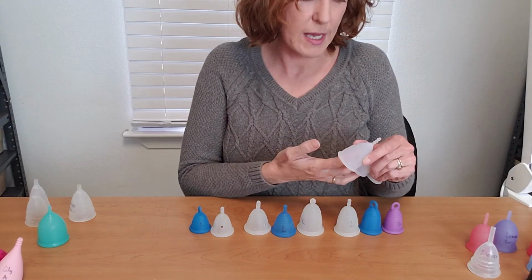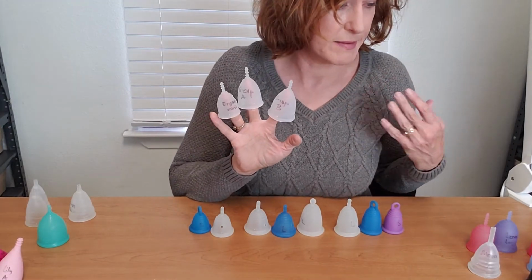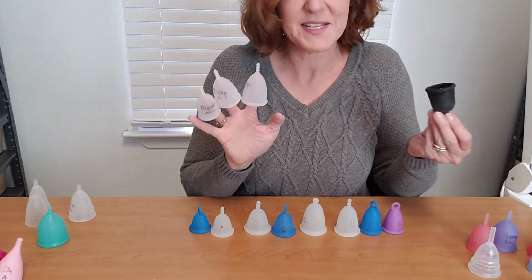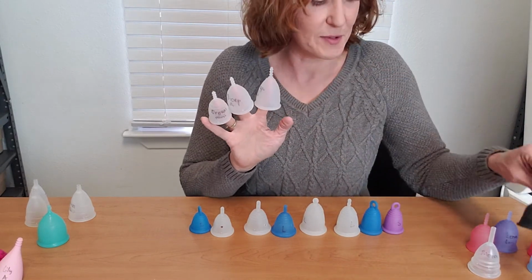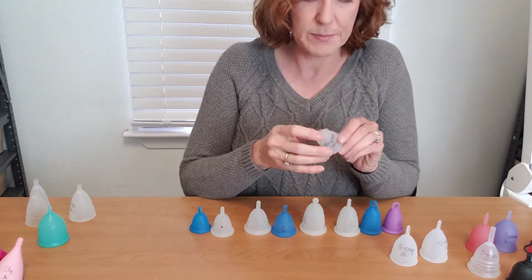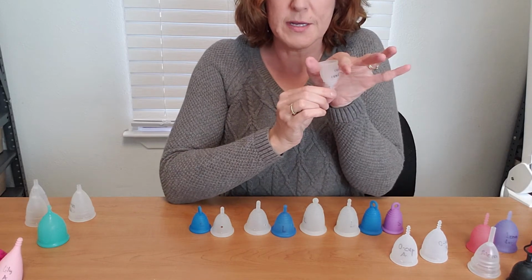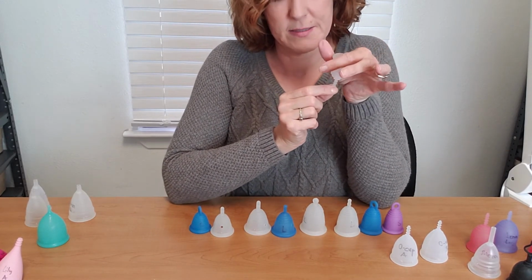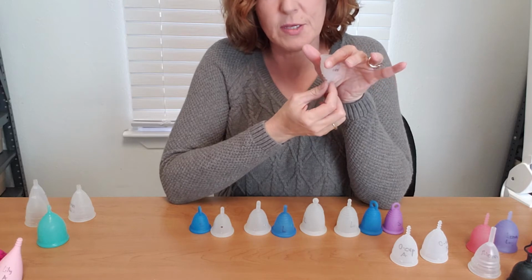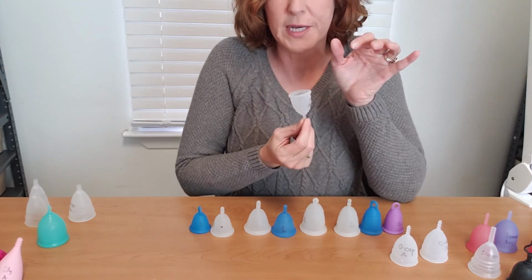The Organic Cup is a very simple cup, and I think keeping it simple to clean and simple to wear is the way to go. That's why these flex cups seem so overly complicated with all that stuff going on. So Organic Cup, we have those here. One of the most common things is that the mini might be hard to reach because, again, the way you remove a cup is you don't just pull on it while the seal is intact. So having a very short, tiny cup when you don't need a short, tiny cup and then getting a longer stem is not really going to help you because you still have to be able to reach it, to squeeze it, break the seal, and then pull it out.